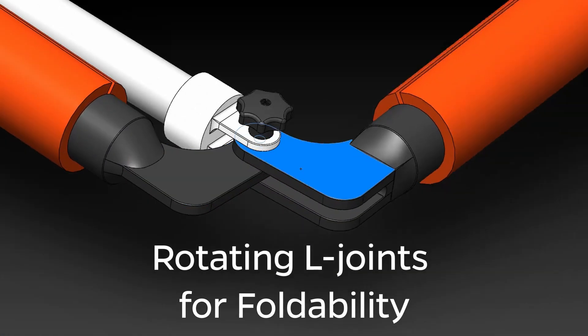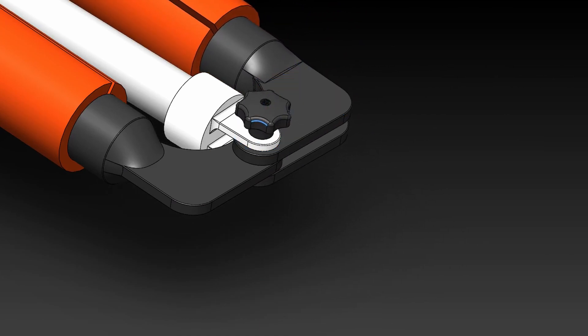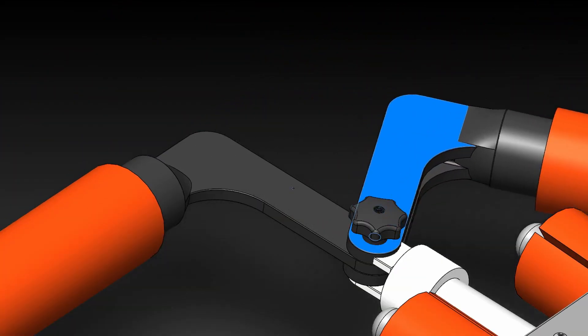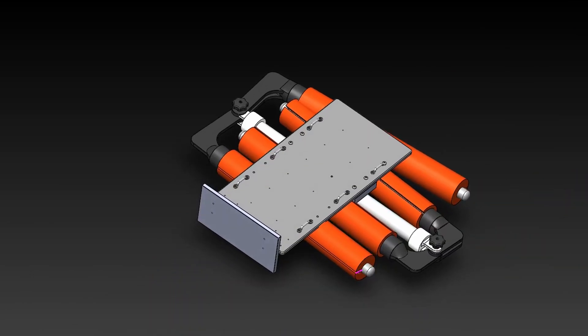In order to stow the device, special 3D printed L-joints are able to rotate inward as shown. Waterproof knobs are used to secure the joints in place. The different sizes of the joints allow for easy storage and portability.